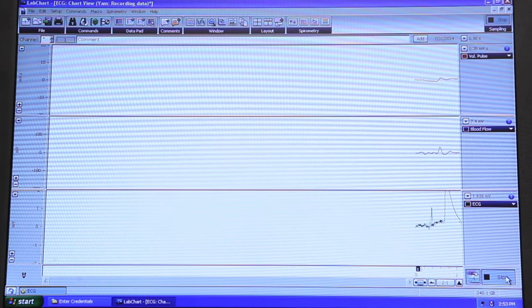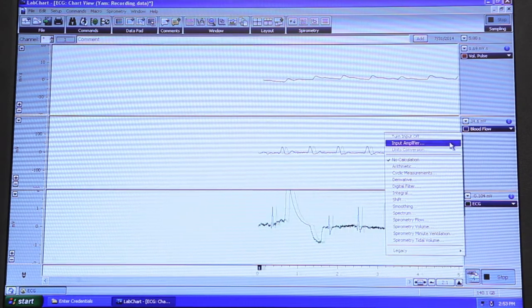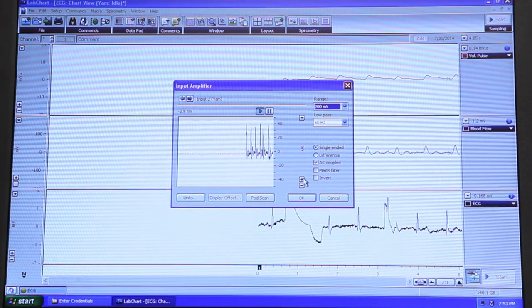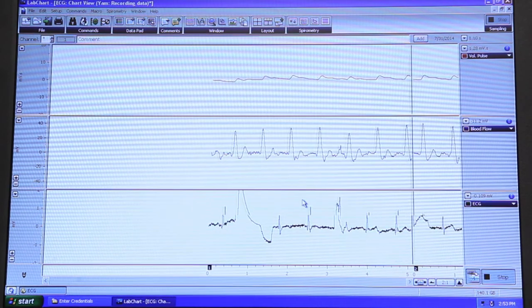Choose the input amplifier option from the channel 2 blood flow channel function pop-up menu. Adjust the range so that the signal occupies about a half to two thirds of the scale when the subject has both hands resting in their lap. Click ok to return to the chart window.